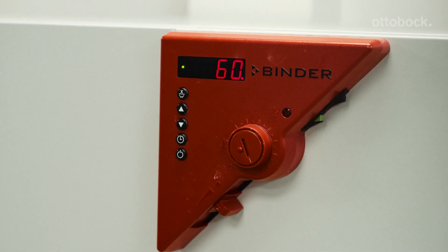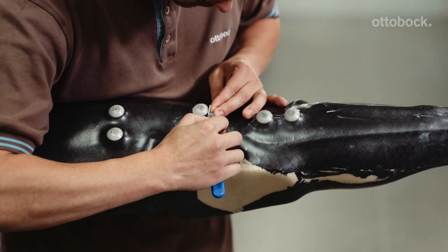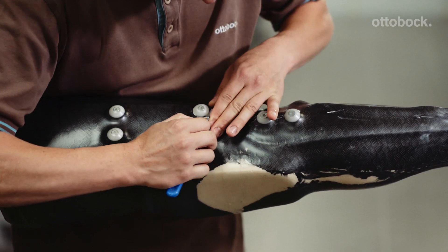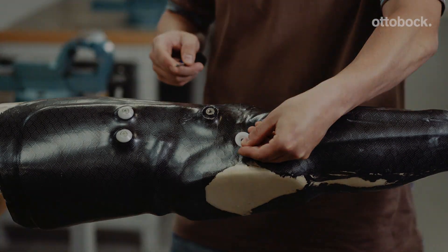Once it is hardened, the orthosis must be tempered in an oven for one hour at 60 degrees Celsius. Remove the orthosis from the oven after the first tempering and allow it to cool.